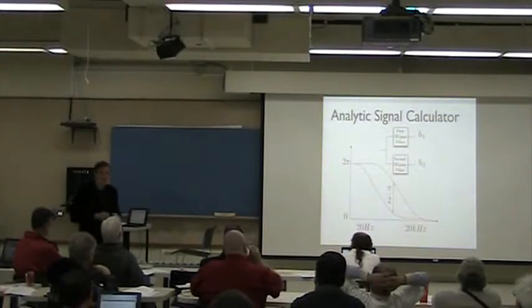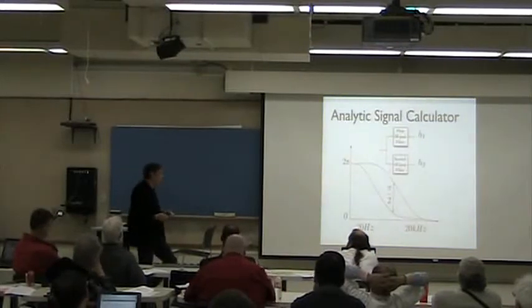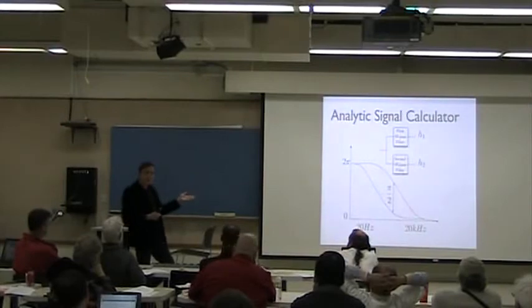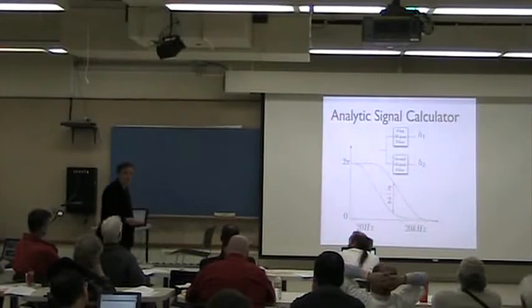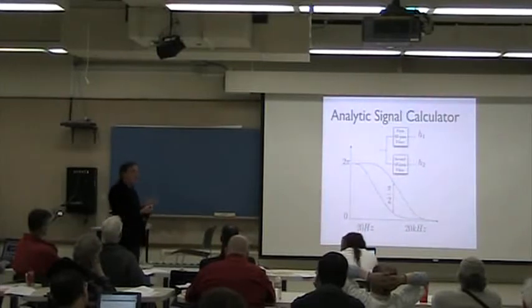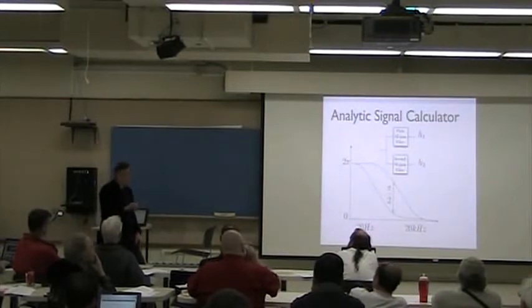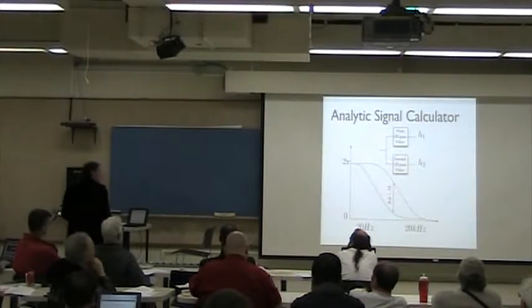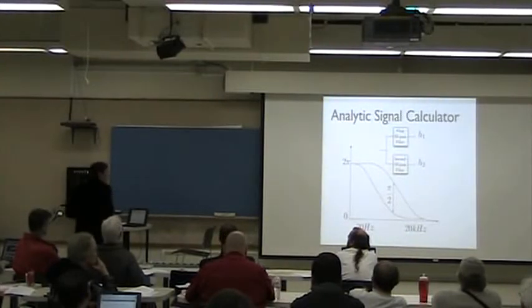Yes, absolutely. When I was trying to understand how old this idea is, it went back to the 70s. So people were playing with this idea even before the digital revolution. This goes back to analog circuitry. But this is a very nice idea, and this is how we do the instant compression. Because to do the compression, you have to figure out the magnitude of the signal. This is the way we do it with only one sample delay. So this is a very nice idea, and I dedicated the whole slide to it.